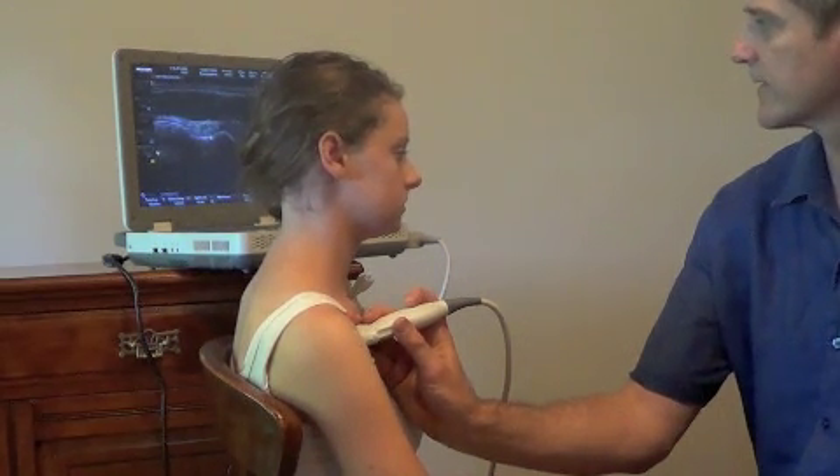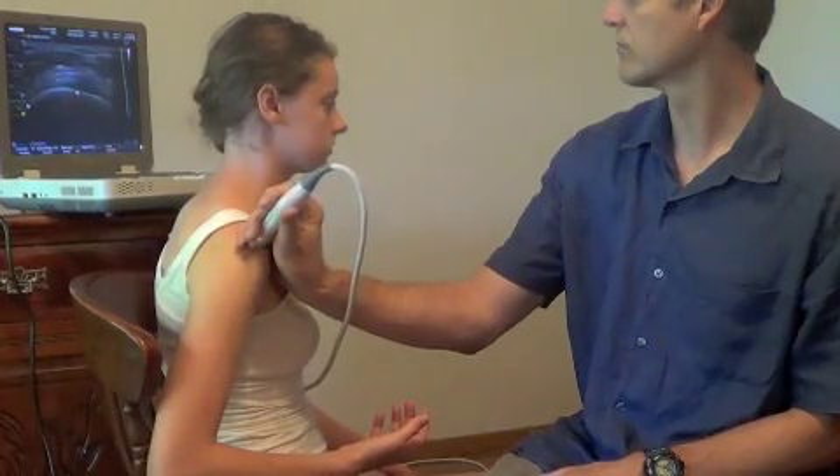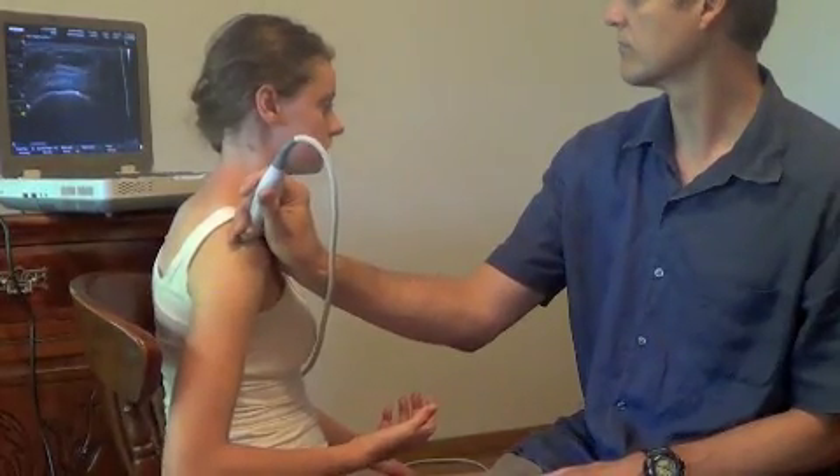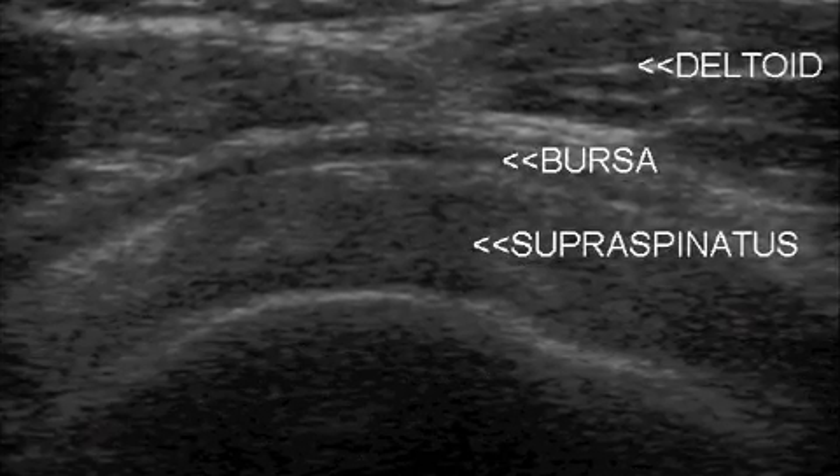Begin scanning the shoulder by finding the bicipital groove and look for the oval biceps tendon within the groove. Once this landmark is found, move the probe laterally and superiorly to find the supraspinatus tendon in transverse.